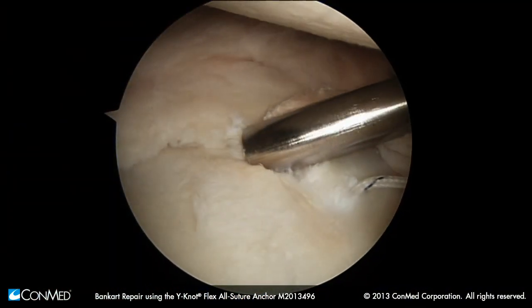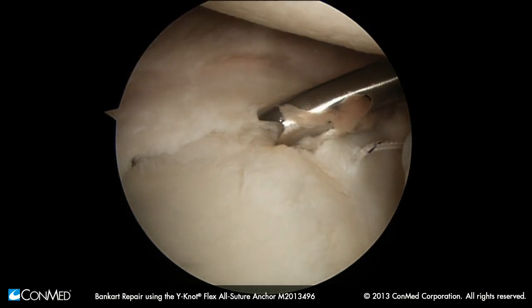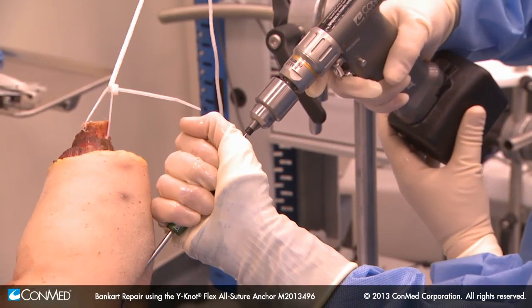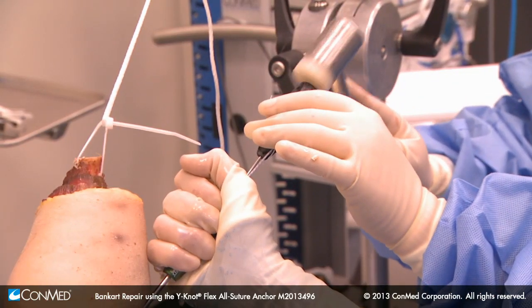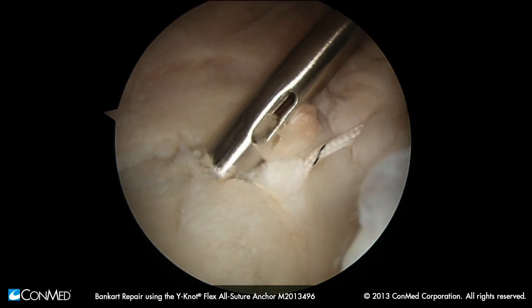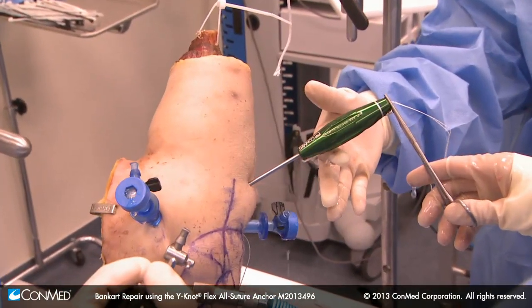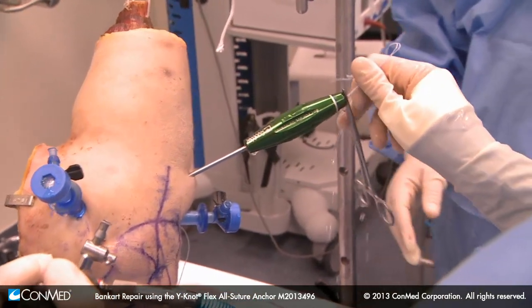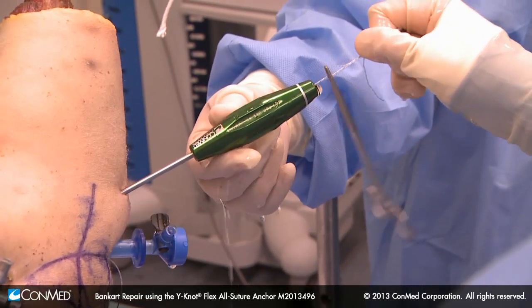The inserter has a bit of a curve on it, which you can appreciate if we spin it around. There's our spot — we'll get up onto the articular edge. This will bottom out; we'll tap it in. And that will also bottom out. This is where I'll take that little snap and put it right on the end of my inserter. So my inserter is on the bone — you can see on the screen — and the snap is out here.